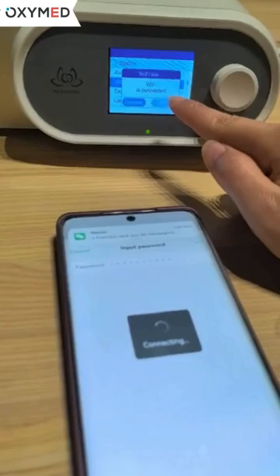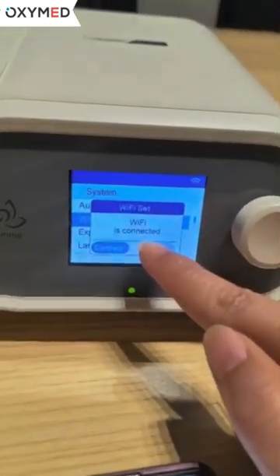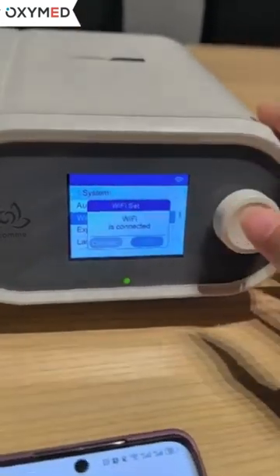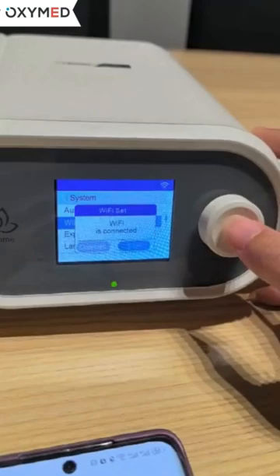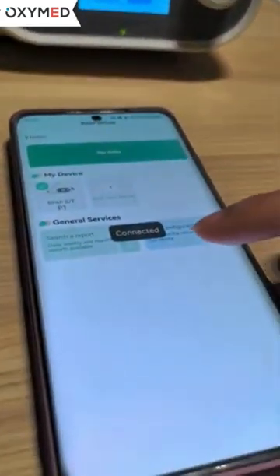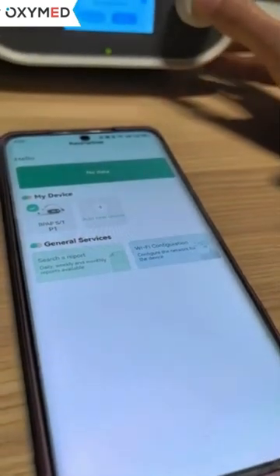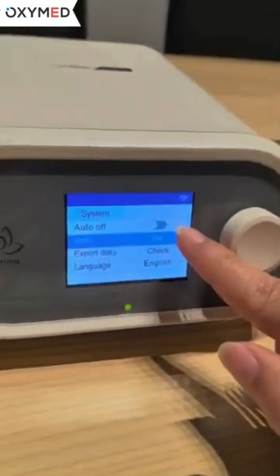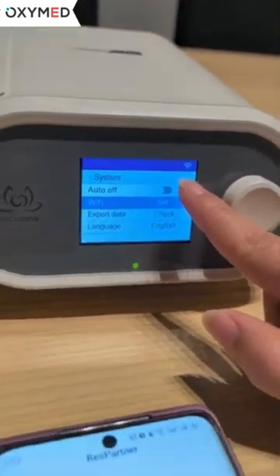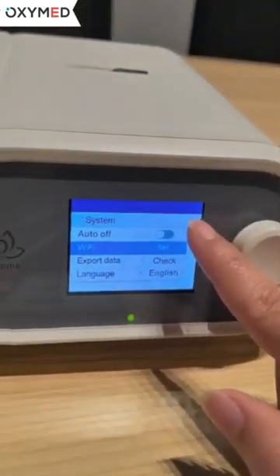After successfully connecting, the device will show 'Wi-Fi connected'. We rotate the control button cursor to exit and wait until the mobile phone shows as connected. This means we have successfully connected the Wi-Fi between the app and the device, and we will see the Wi-Fi icon in the top right corner of the device.